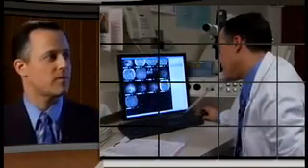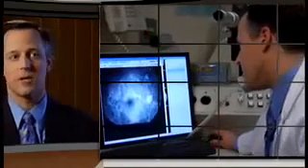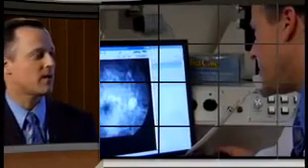Even transcontinental. We have an adjunct faculty member in California, and one night I had a question about whether a patient may be able to be enrolled in a study, and I was able to pick up the phone, call her in California, and have her pull up the images right on ANCA as I was viewing them in Illinois.